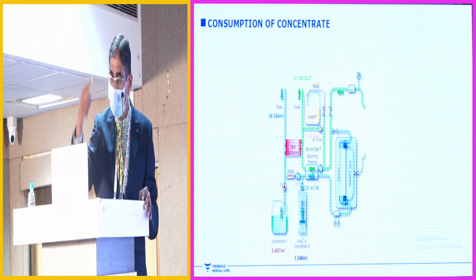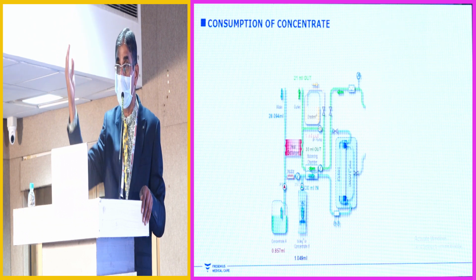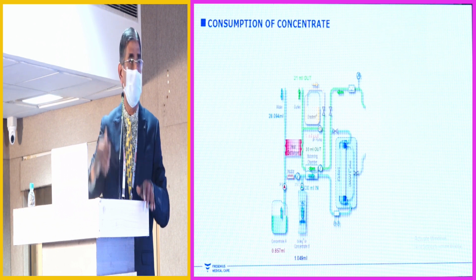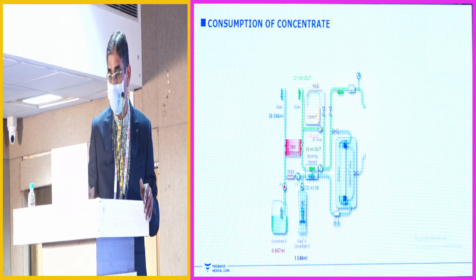So to repeat it, the balancing chamber is only to pull the fresh fluid, go to the dialyzer, and the spent fluid will come on the other side of the balancing diaphragm, and then it will go out. The extra fluid from the patient body goes directly. It will not enter the balancing chamber.